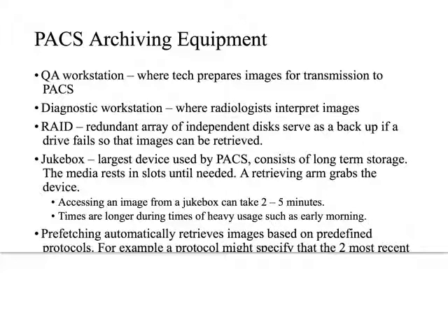The jukebox is really cool, and it's worth maybe visiting the PACS room to see it. I think the word jukebox is kind of demeaning, because this is a very, very large machine with robots inside of it. It has robotic arms that move throughout the jukebox and pull out different file disks. And it takes them about 2 to 5 minutes to access something that's in that deep storage.